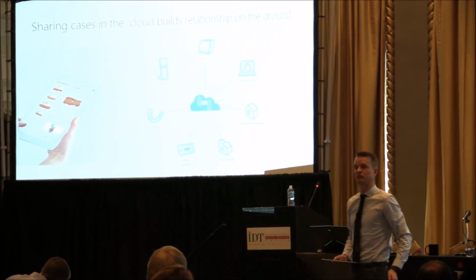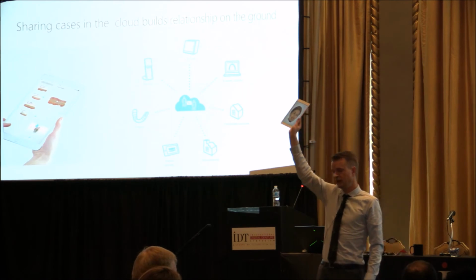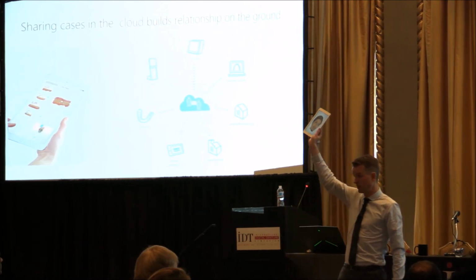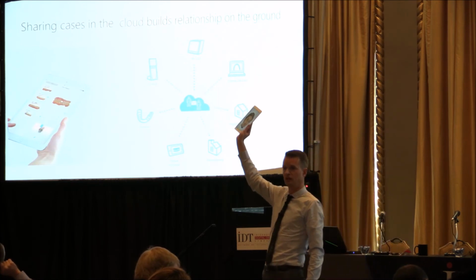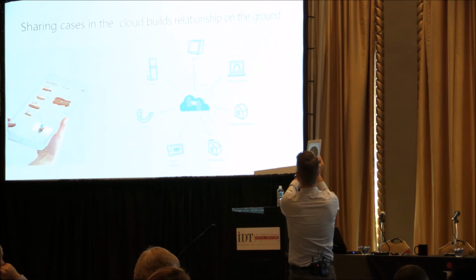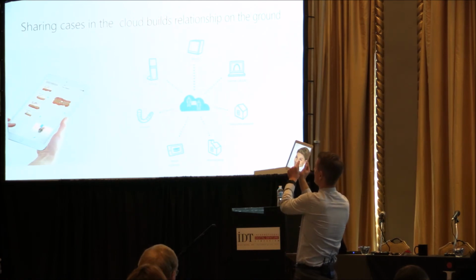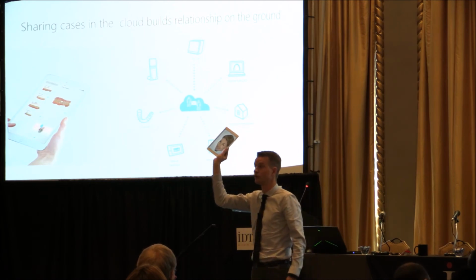Another cool thing about the future is there will also be face scans. So face scan is going to come. Let's see if the iPhone 10 can do it. It has a built-in small low-res 3D scanner, so it has the potential to do it. We also have a CBCT scanner here that can do face scans. The problem with face scans today is typically that the teeth are not scanned good enough, so we need to merge them with a high-quality intraoral scan.